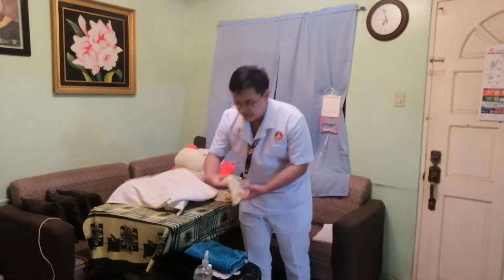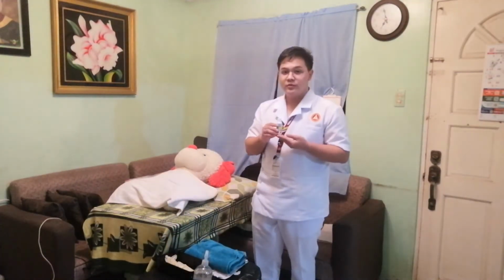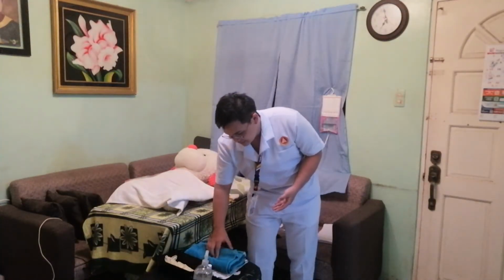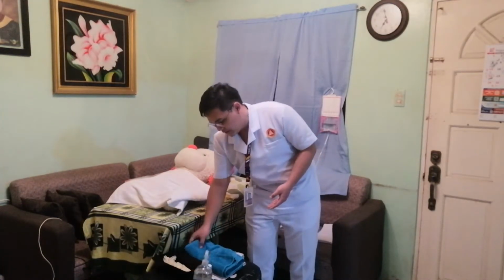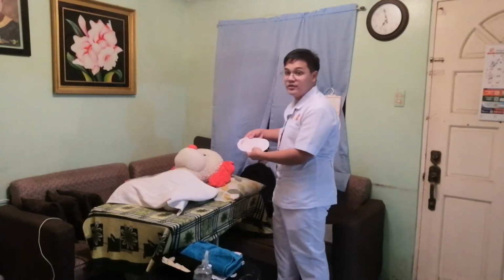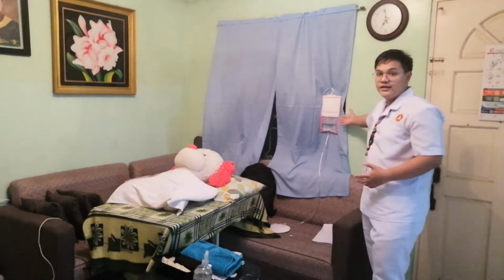Also, we do need to have some clean gloves, a water-soluble lubricant, for example, and also a paper towel. So for example, this is a paper towel. Okay. And lastly, for our next equipment, we do need to have an enema solution.